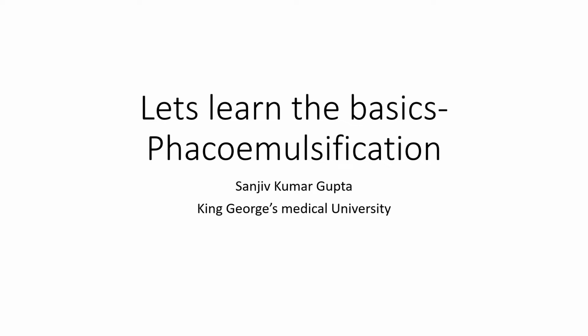This is one presentation which I had given at a meeting at Hind Medical College, and it was a PG program in which postgraduate students of ophthalmology were involved, who were supposed to be having some talk on phacoemulsification and other methods of cataract surgery, as well as introduction to phacoemulsification, not only as a theoretical part but a live surgery also. So I performed a live surgery on a patient with grade 5 cataract doing primary horizontal chop.